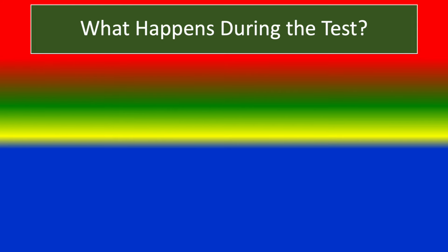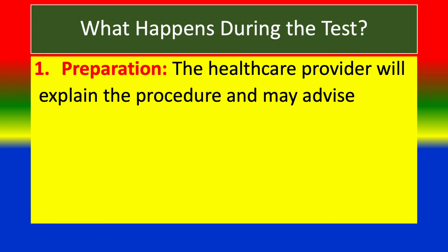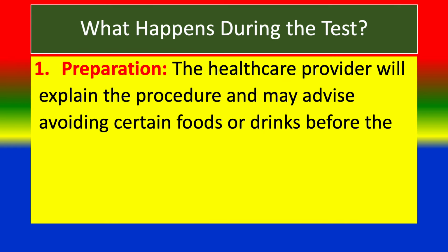What happens during the test? 1. Preparation. The healthcare provider will explain the procedure and may advise avoiding certain foods or drinks before the test.